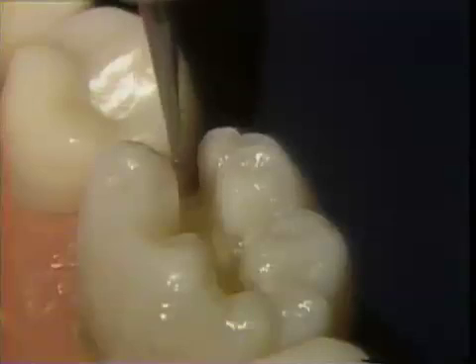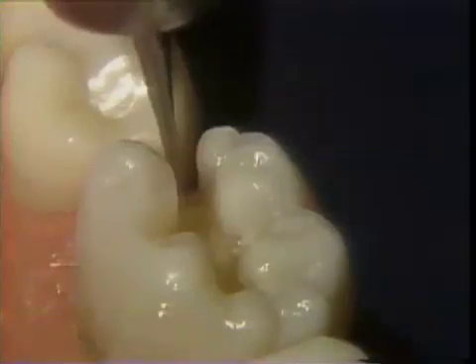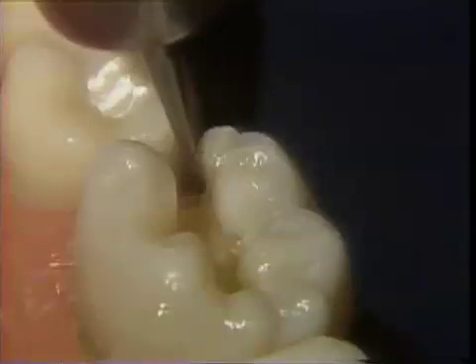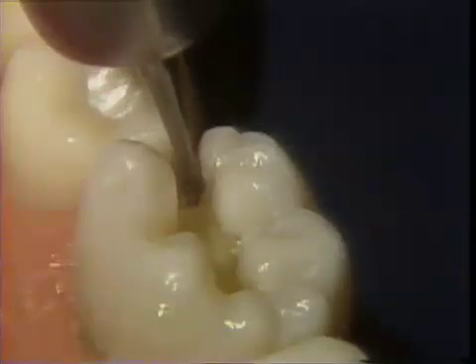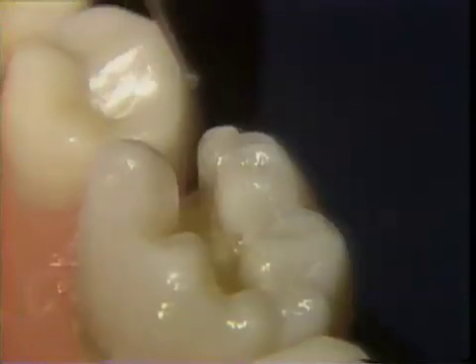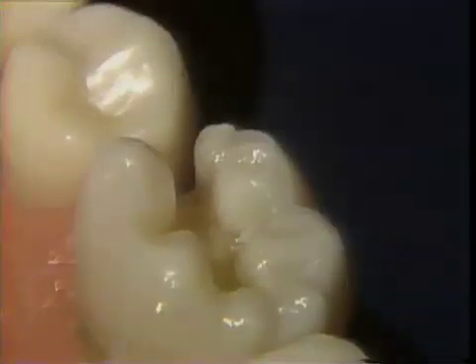A number one-half round burr is used to place round retention in the proximal walls. The burr is placed one-half its width into dentin just inside the dento-enamel junction at the cervical floor, and is stroked occlusally to the height of the pulpo floor.